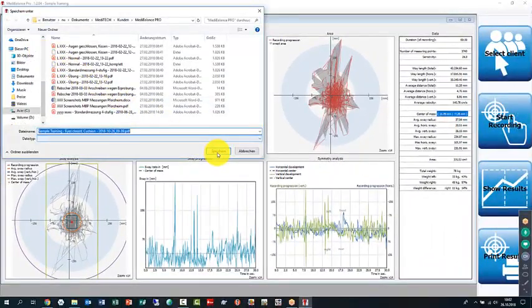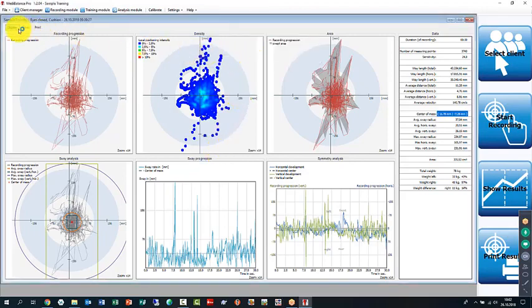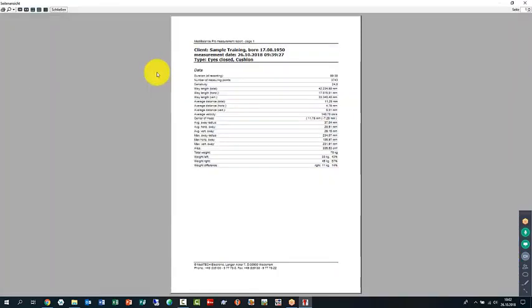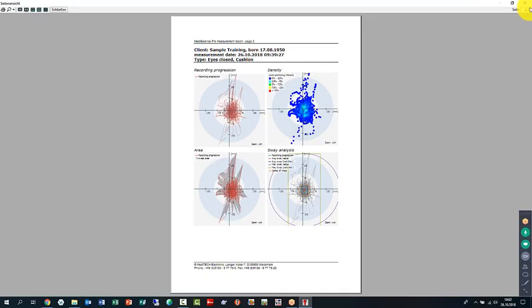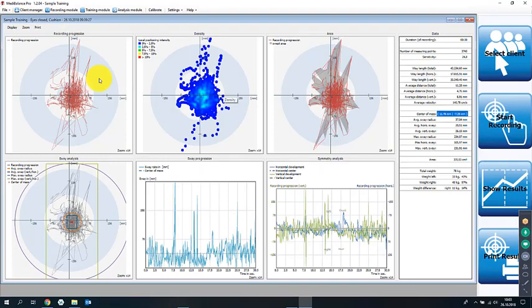And then it could create a PDF file for me here. And I could just put that on file, put this in my record, or I can do a preview here to show you better what the client actually gets to see, which is the numbers, the graphs. So everything that I have on here, I get as a full report for the client. That's what the system can do in terms of reporting. I can adjust the way it appears and have a pretty good analytical functionality for the system in that scope.